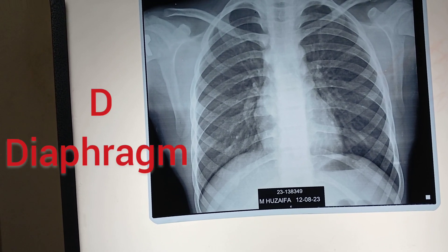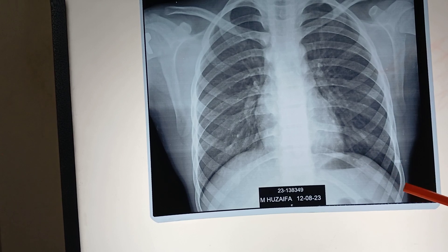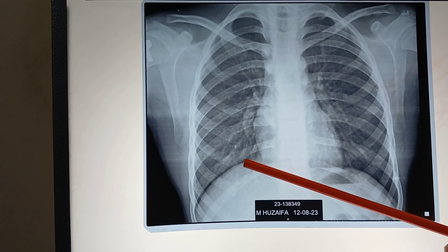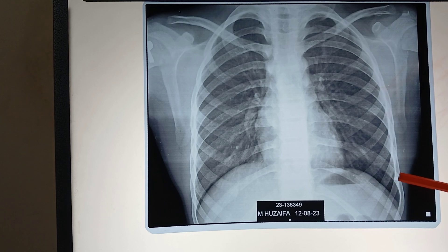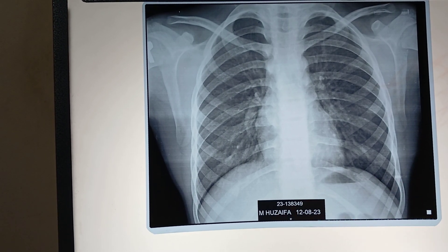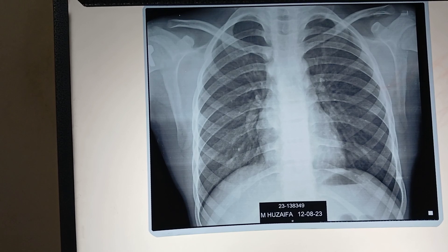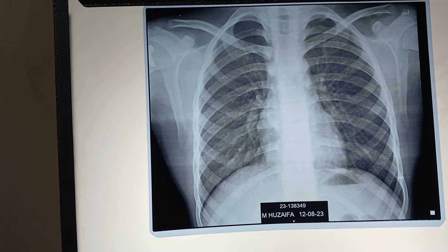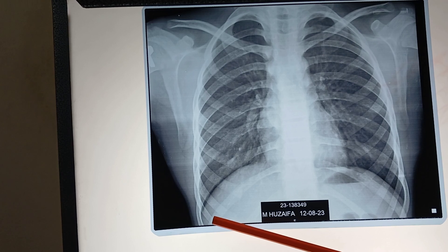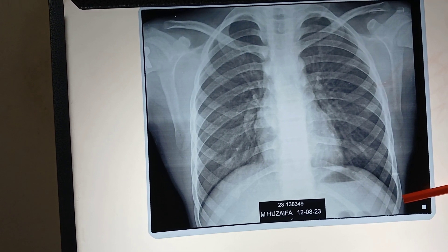The next mnemonic is D, which is diaphragm. Check the right hemidiaphragm, right costophrenic and cardiophrenic angles, and the left hemidiaphragm. In healthy individuals, the right hemidiaphragm is higher than the left hemidiaphragm, due to the heart on the left side. Below the left hemidiaphragm, the gastric bubble is seen. If air is seen below or beneath the right hemidiaphragm, it is an alarming situation as it represents air due to perforation, termed pneumoperitoneum. The CP angles should be sharp. If blunting or obscuring of the CP angle is seen, then fluid is present in the pleural cavity, termed pleural effusion.